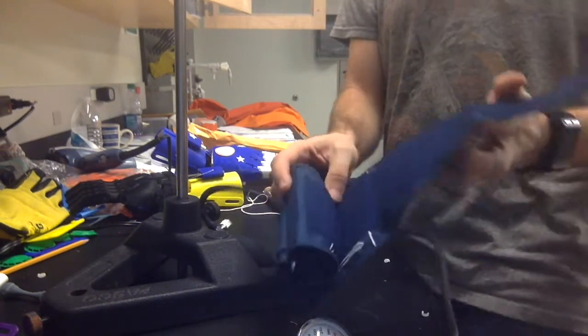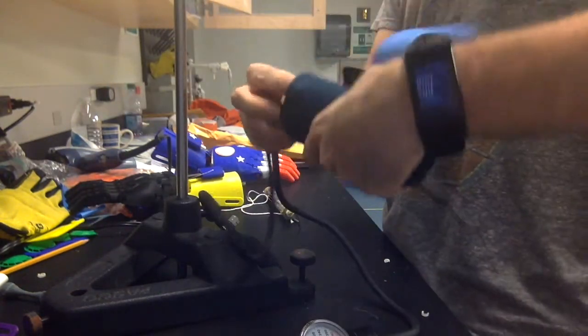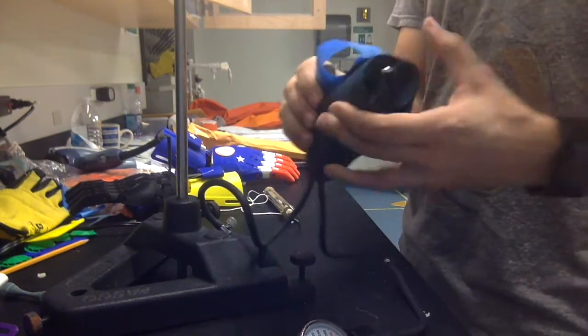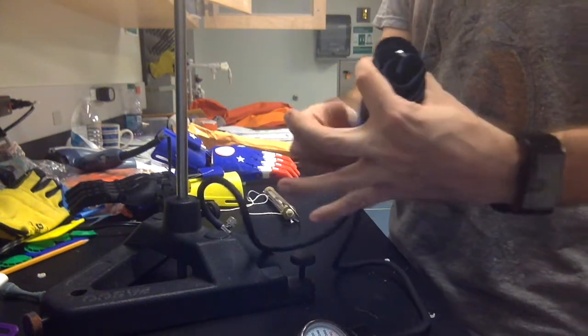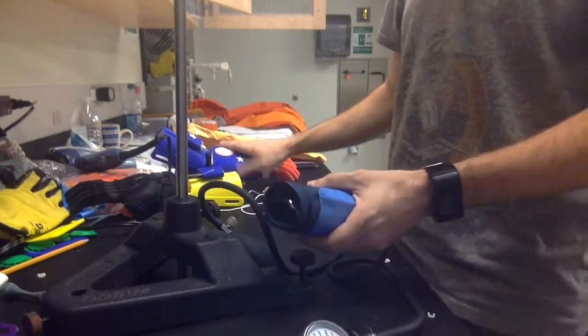So it's very simple. Anybody can do this if you have a blood pressure cuff, and you can get an idea of what kind of grip strength you're getting out of your e-nable devices.